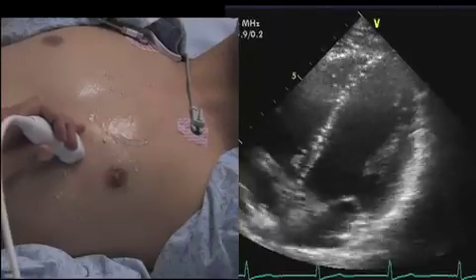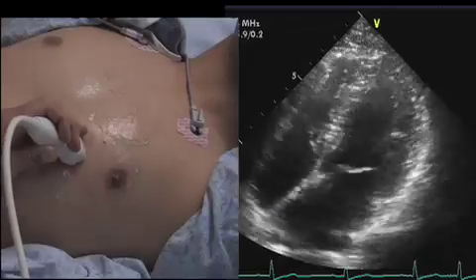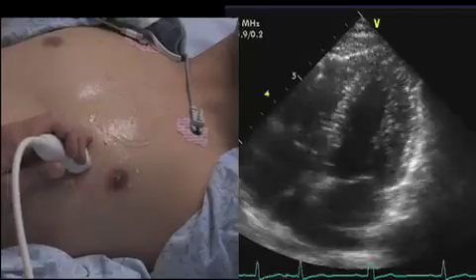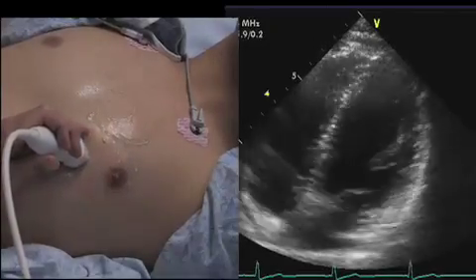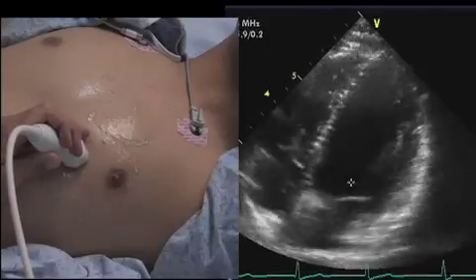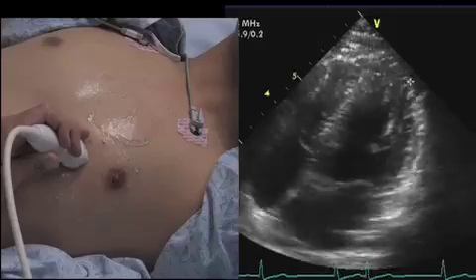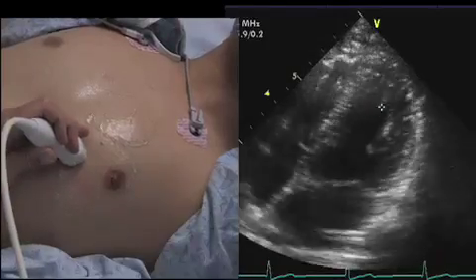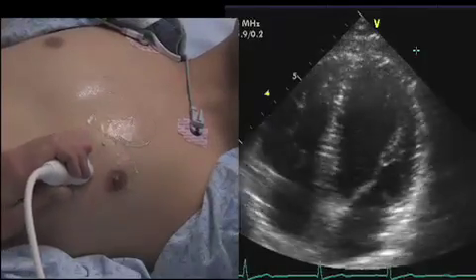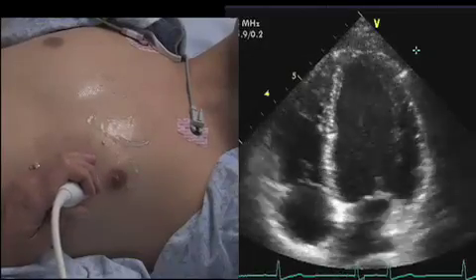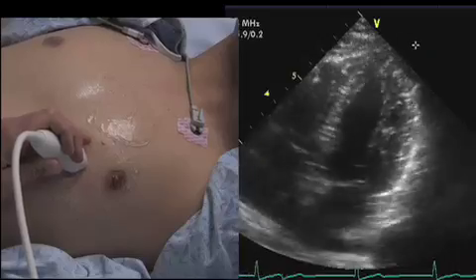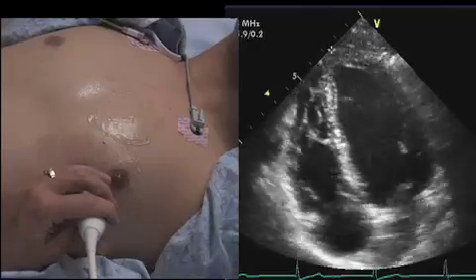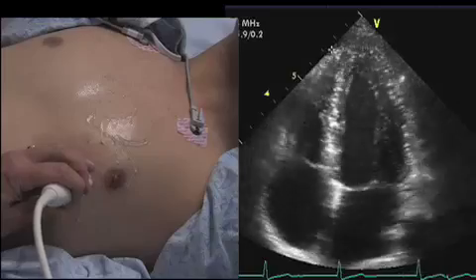Often when I'm working with students, I'll see a 4-chamber like this — quite good, with the apex well seen, good endocardium, all chambers present, mitral and tricuspid well seen — but the whole heart is aiming off the screen the wrong way. To fix it, look at the probe hand: if the apex is pointing off to the right, move the probe to the right, and now it becomes more vertical. If the apex is pointing to the left, move the probe to the left, and again the apex becomes more vertical.